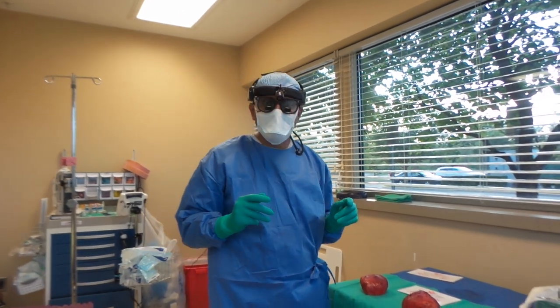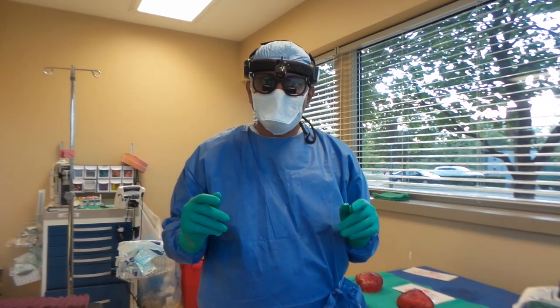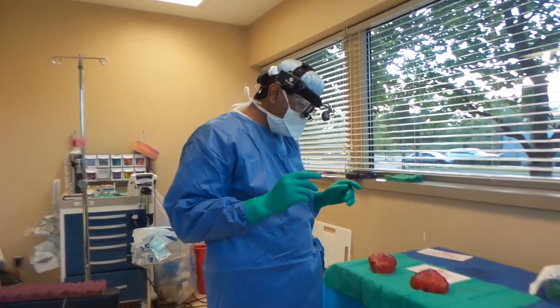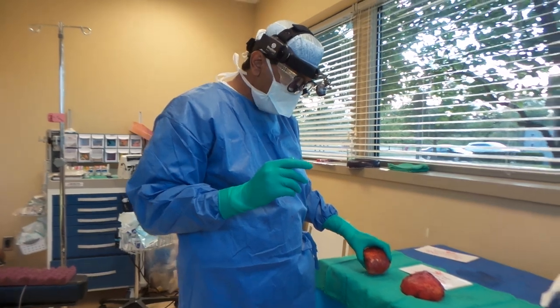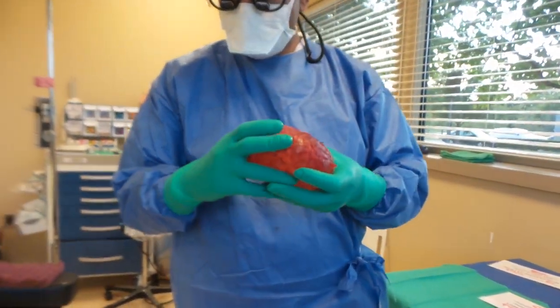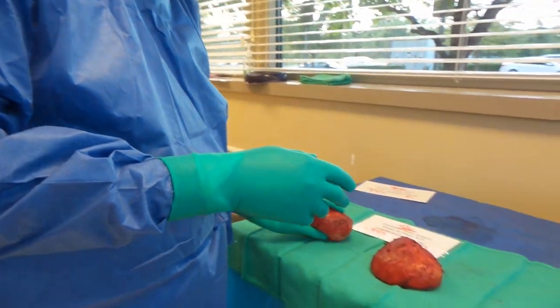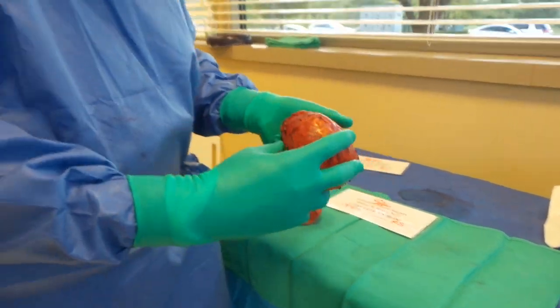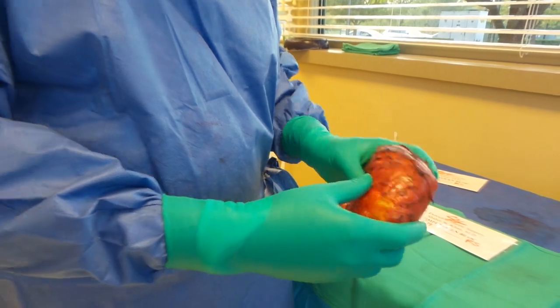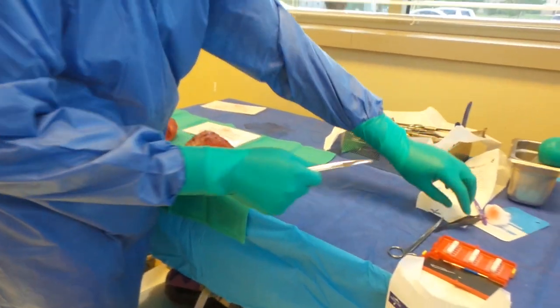Today I've done an en-bloc resection of the right and also the left side of the chest on a young, healthy lady. As you can see, this is an en-bloc resection on the right side, completely removed en-bloc, and another one en-bloc done on the left side. What I'm going to do next is go ahead and open these up.